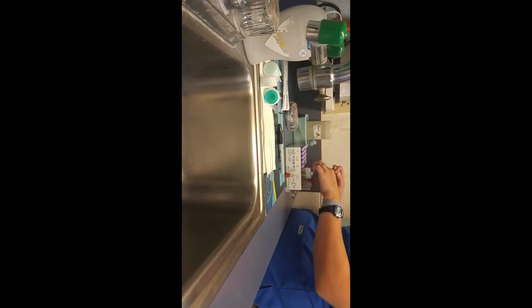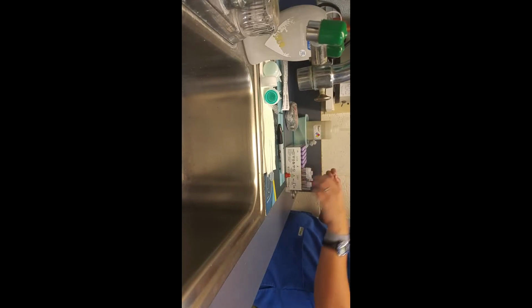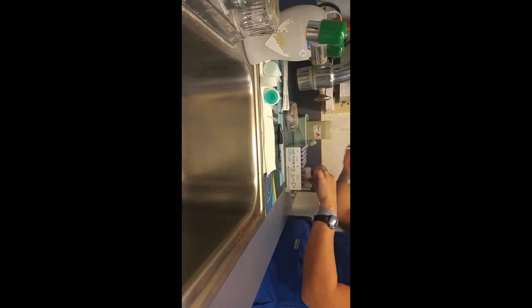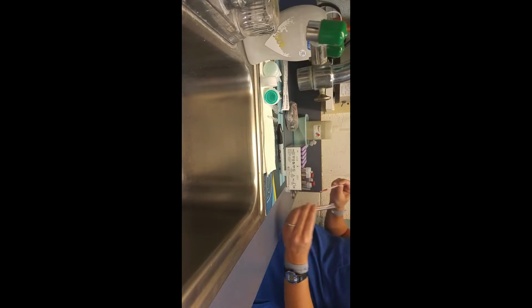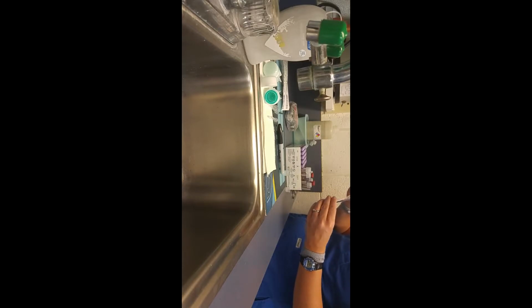Same thing, only with the recipient's cells. Again, checking to make sure that this is the recipient before I drop the cells in there.